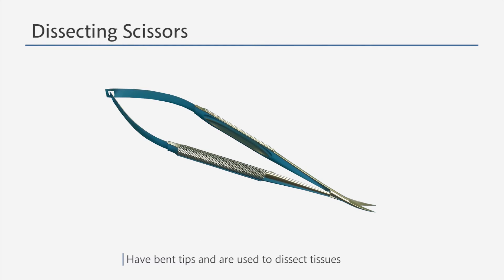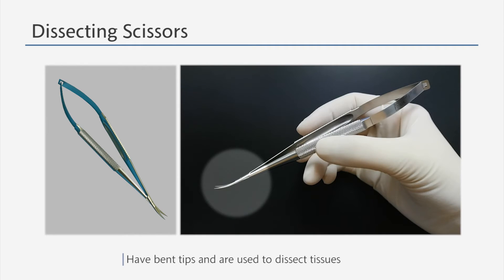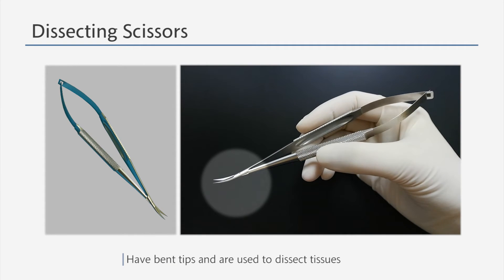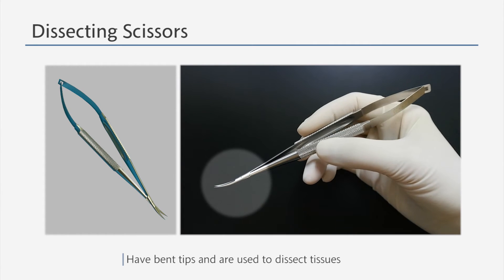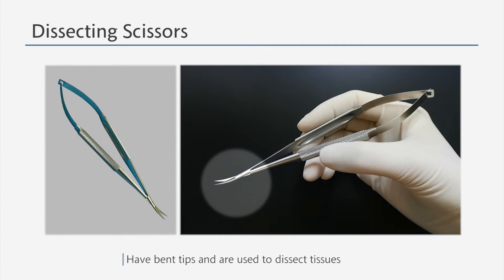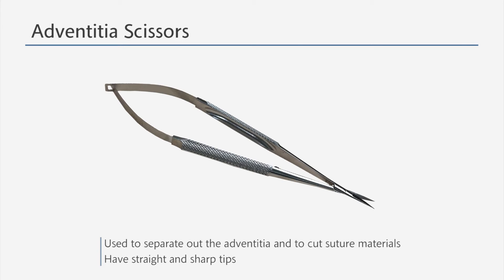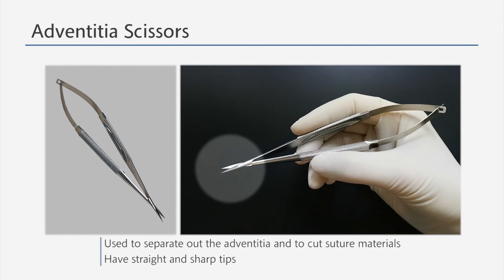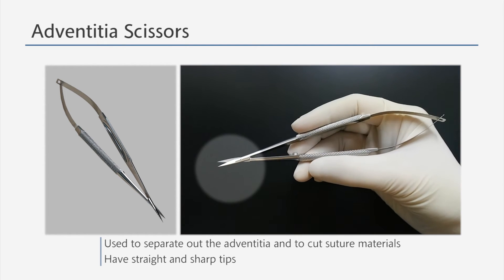Dissecting scissors are used when dissecting tissues. The tip of the scissors is bent so that one can dissect very close to the vessels with a lower chance of perforation. The adventitia scissors have a sharp and straight tip and are used to separate out the adventitia or to cut suture materials.